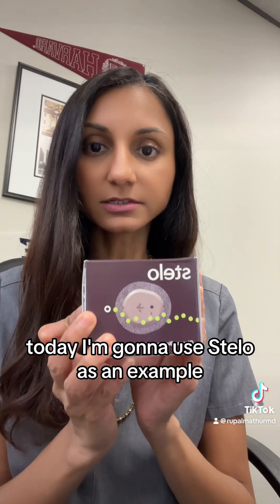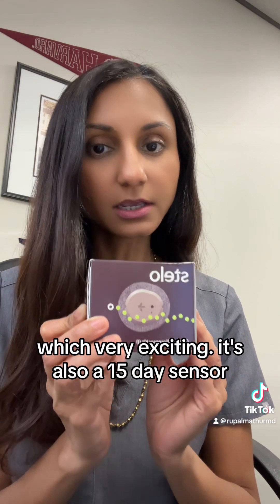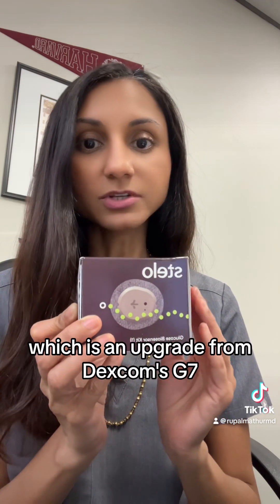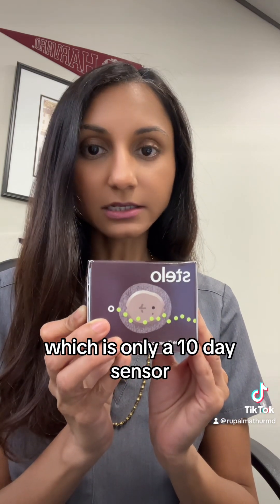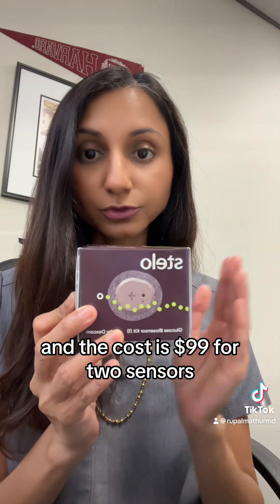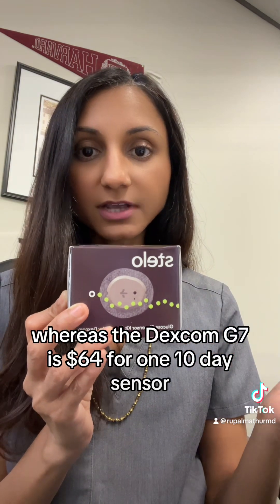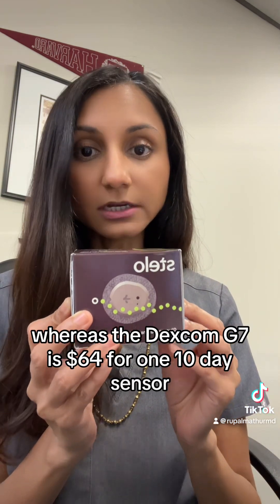Today I'm going to use Stelo as an example. Stelo is the latest CGM to hit the market and it does not require a prescription, which is very exciting. It's also a 15-day sensor, which is an upgrade from Dexcom's G7, which is only a 10-day sensor. The cost is $99 for two sensors, so for a one-month supply, whereas the Dexcom G7 is $64 for one 10-day sensor.